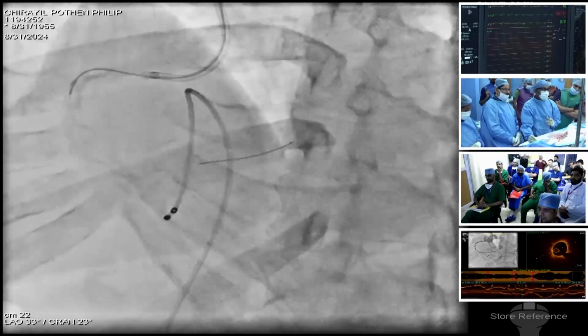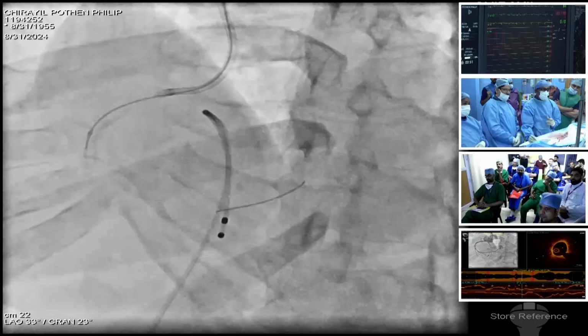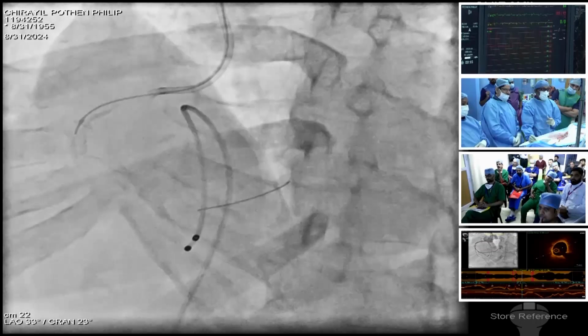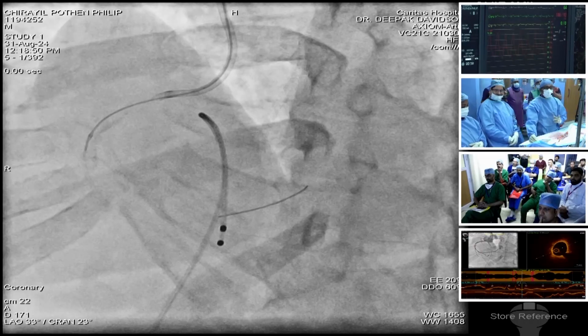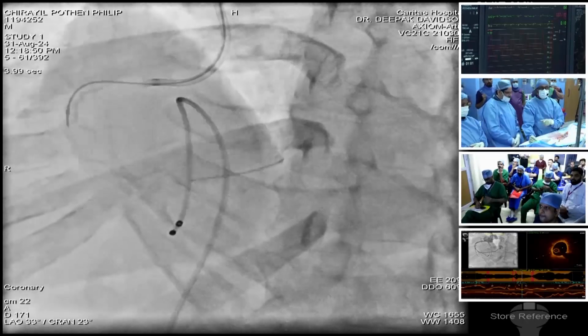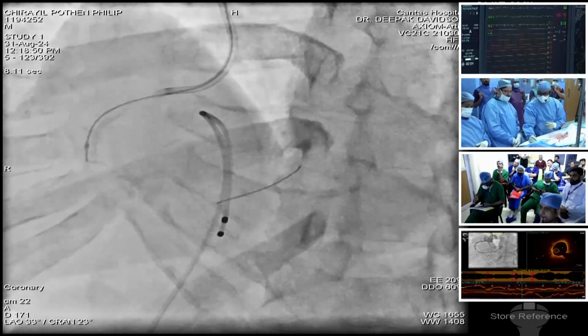He can appreciate some change of the pitch. It's the tightest lesion. Now shall we go for one more run and then switch over to the imaging catheter? Yes. Be ready with the run through wire.